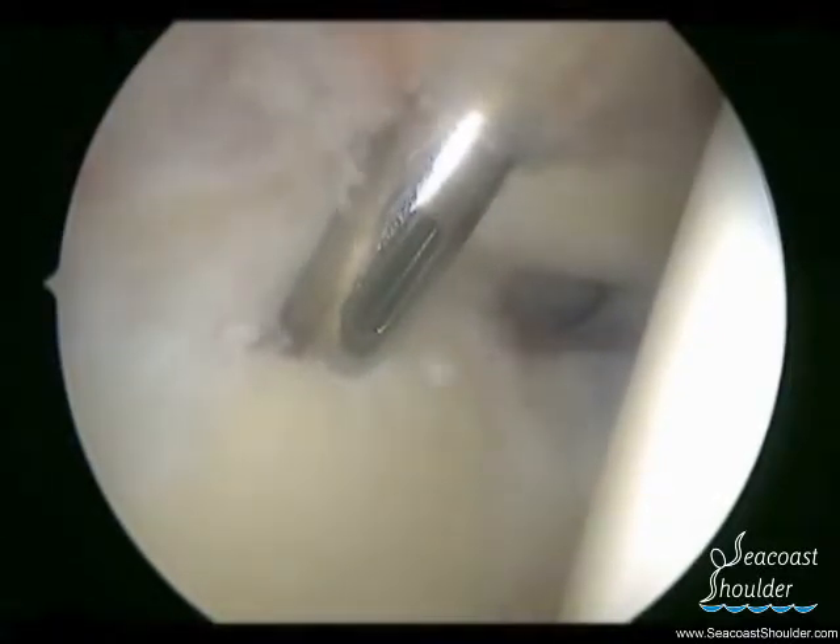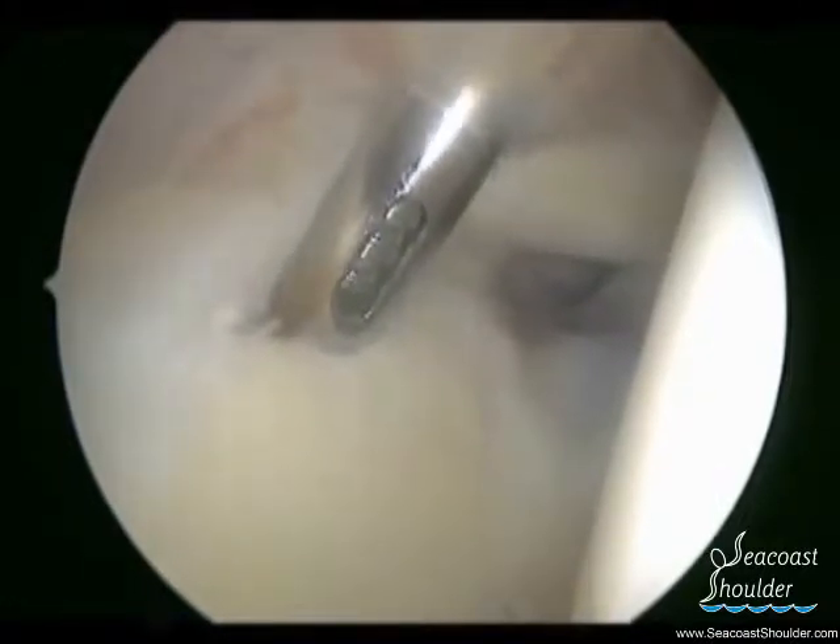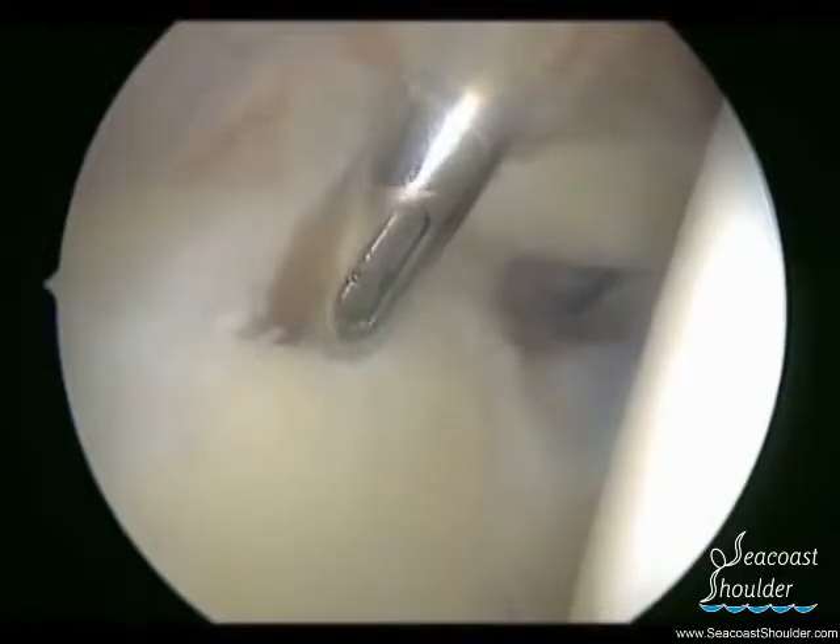In this example, the superior labrum has detached off the glenoid, and we have prepared the superior glenoid with a shaver and burr to remove all unhealthy tissue.